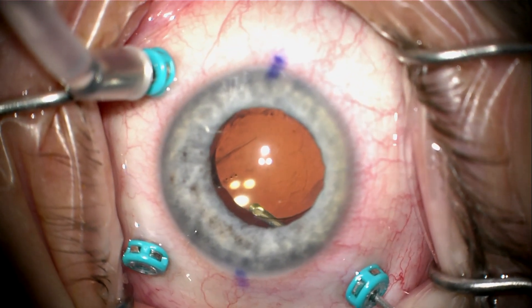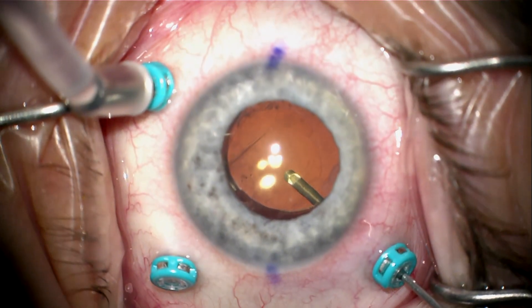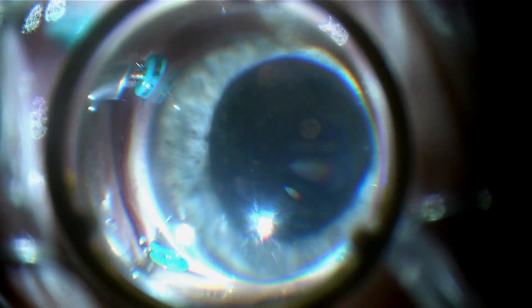Here we're performing a vitrectomy and cleaning up this turbid, cloudy vitreous that has a lot of debris left over from when she had endophthalmitis, which she has mostly recovered from. We've completed an anterior vitrectomy through the pars plana. Her macula looks great.